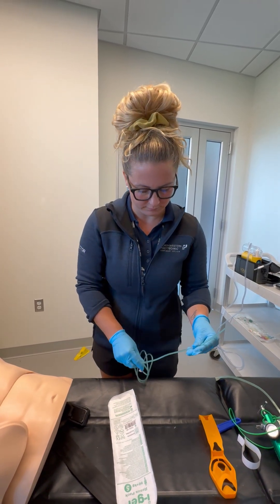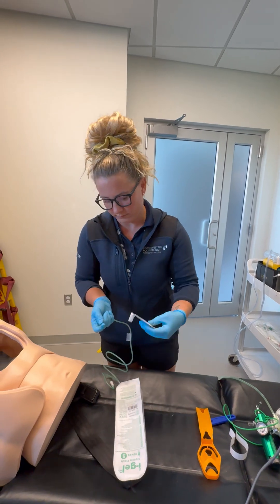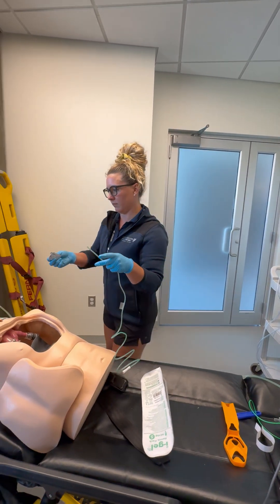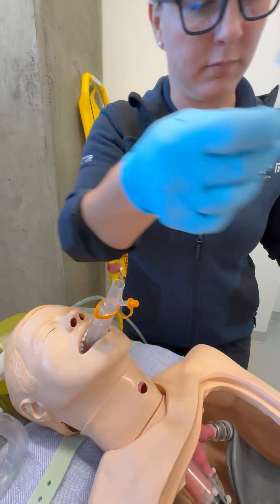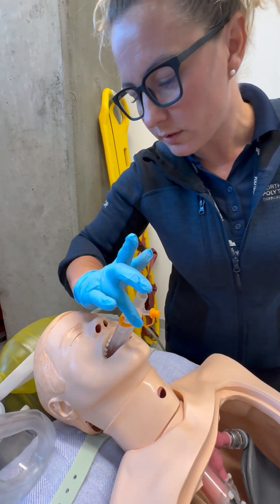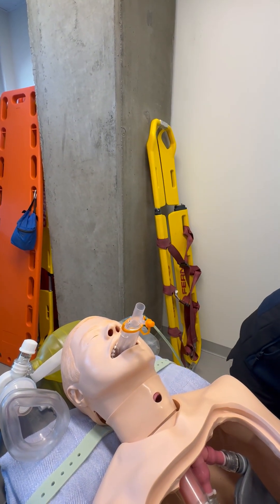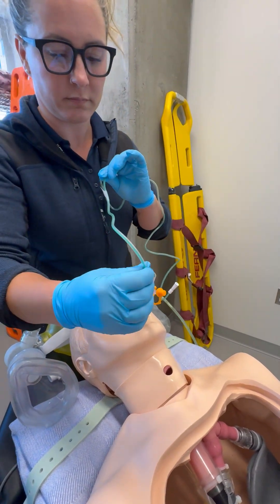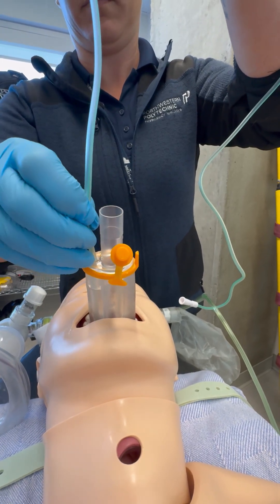You'll apply lubricant over the proximal end of the gastric channel of the i-gel — not the suction catheter. You will then insert the suction catheter through the lubricant and into the gastric channel of the i-gel until the taped depth indicator reaches the outer edge of the channel.